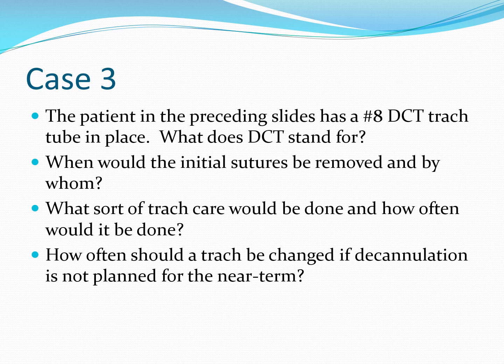There's a suture removal kit, and just take great care, cleaning the site where the stitches have been removed and making sure that all the suture material has been removed. It could be a potential cause for infection, so it's of critical importance to do that. What sort of trach care would be done and how often would it be done?